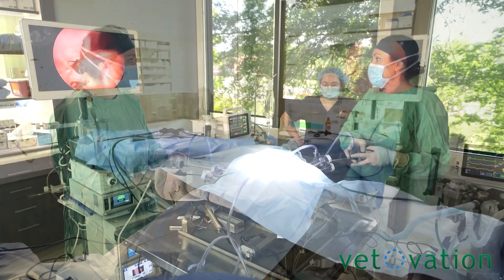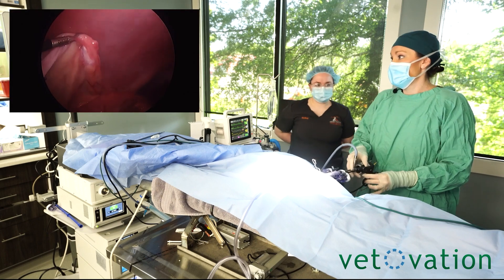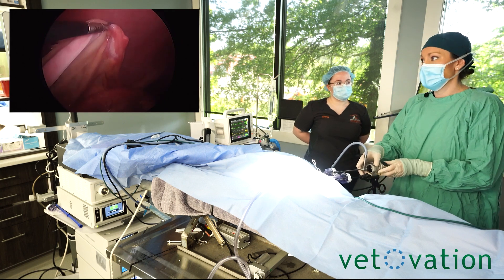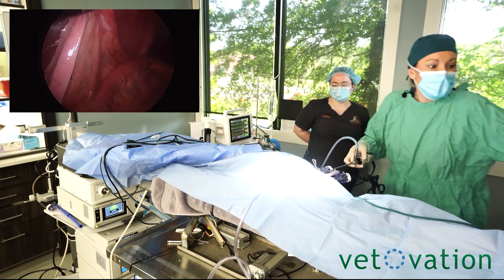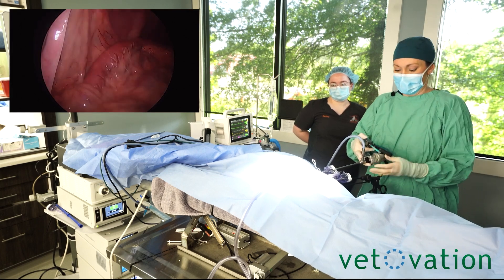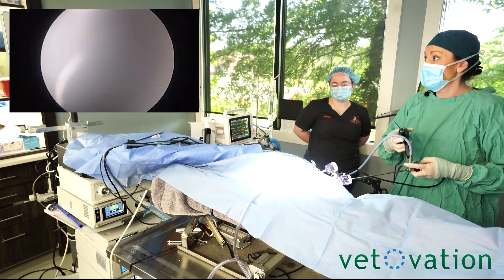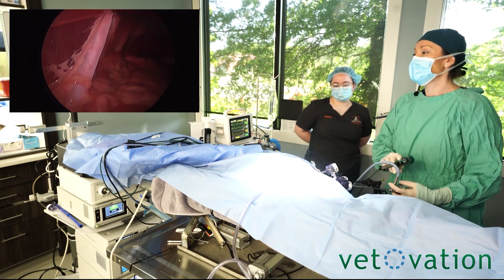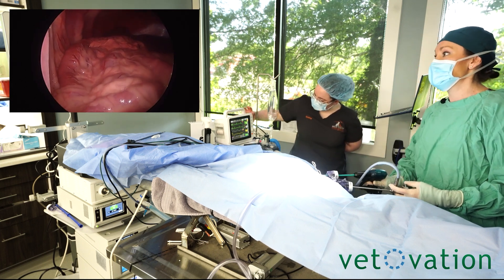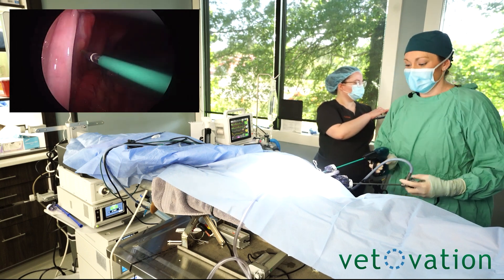I'm going to tilt her back so we can see. After you clamp it on there, you're just letting gravity hang. For a normal dog spay — say a 30, 40, 50 pound dog — the laparoscopic spay takes about 20 minutes from cut to completion, skin to skin.